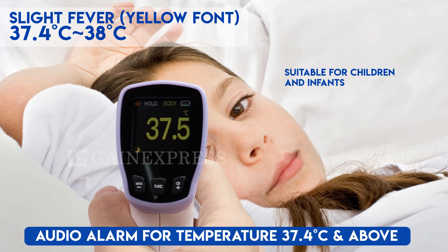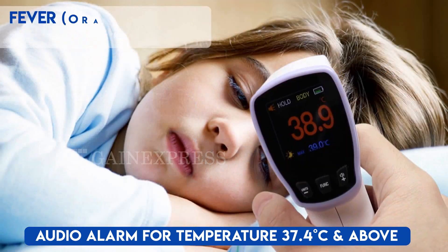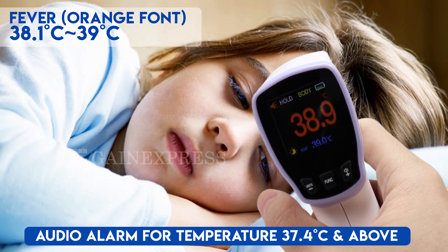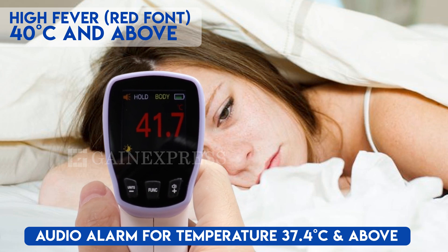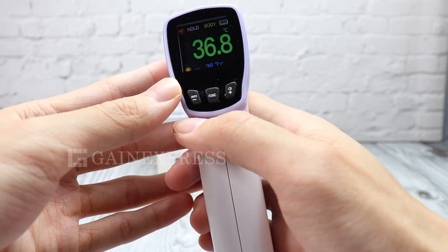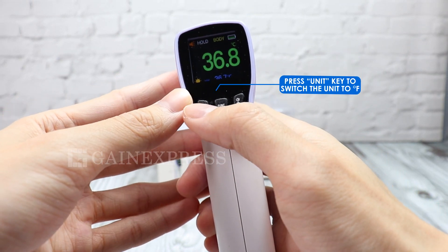For slight fever, the font becomes yellow and an alarm will be heard. Orange font will be seen if the temperature is between 38.1 and 39 degrees Celsius. Red font is for high fever.